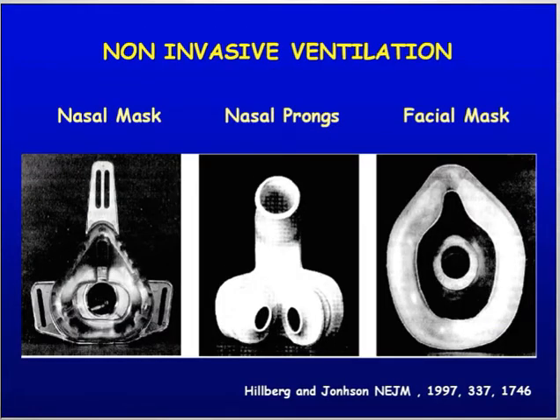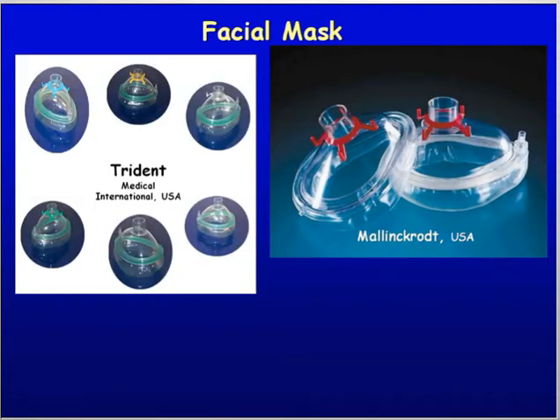As already alluded to by our chairman, the major issue there is that the interface is different than during conventional mechanical ventilation. You know that you can use a nasal mask, nasal pillows, or facial mask. In the ICU, in most cases, we use those facial masks covering both the mouth and the nose for many reasons, including the fact that many patients are mouth breathers, and it will be very difficult to ventilate them only with the nose.